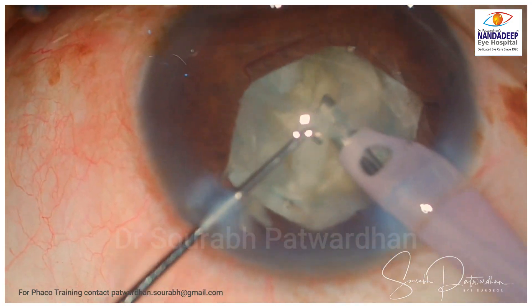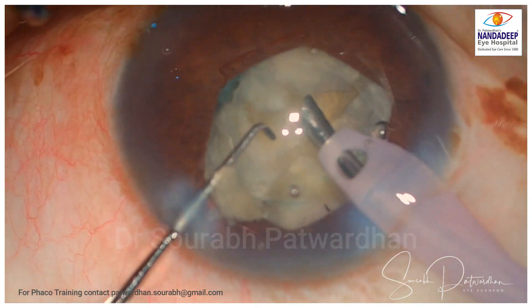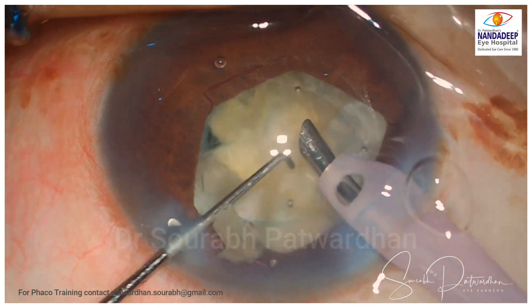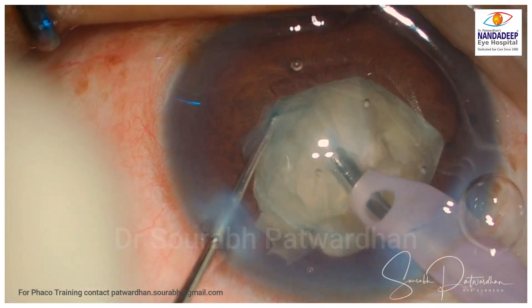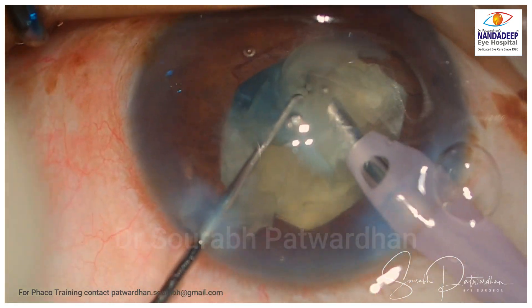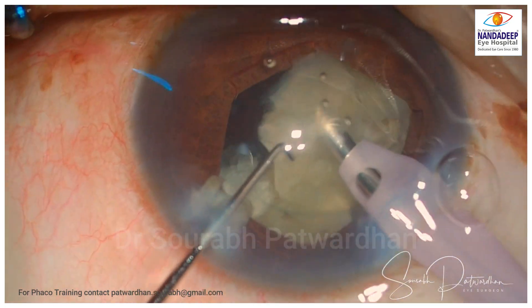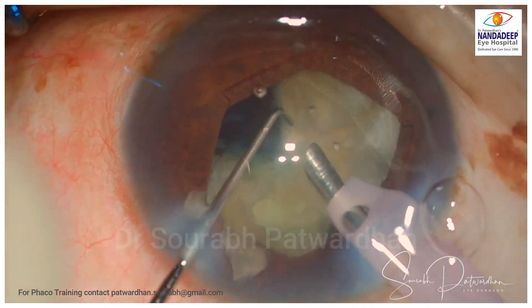Once the chopping is done, I am going to do the quadrant removal. You can see my FECO tip is now sideways or slightly pointing down — this helps in easy occlusion and rapid removal of the quadrants. Some surgeons are afraid of aspirating the posterior capsule by keeping the bevel down, but if you have the right fluidics, you need not worry about it. Of course, as you go toward the last piece, you can flip to bevel up and reduce the parameters.